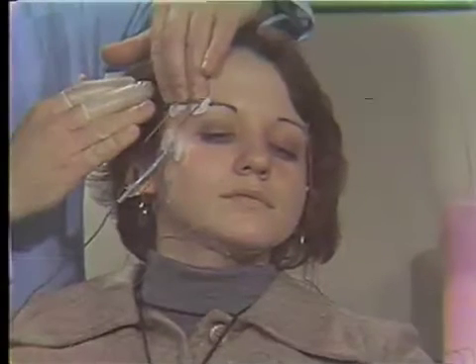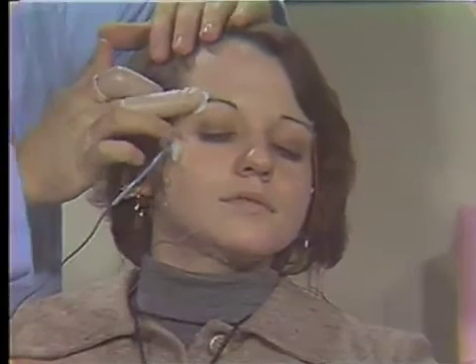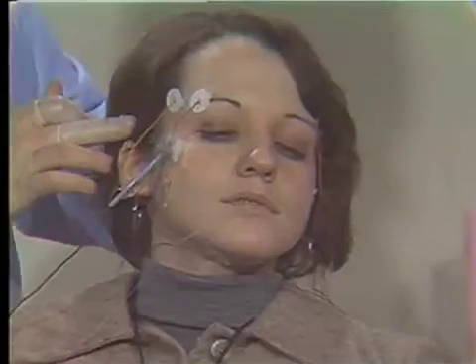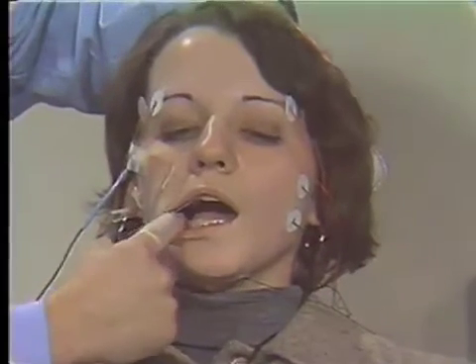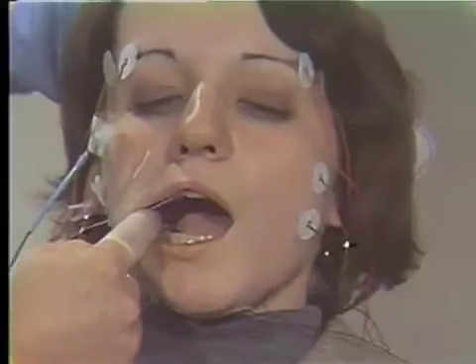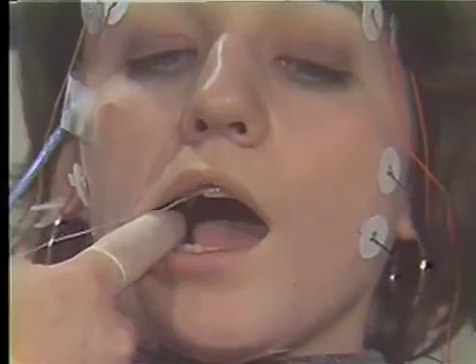Temporalis — just clench for me. Relax and you'll see the movement. And this is where our temporal electrodes go. Two muscles that we can't reach with surface electrodes: just open wide — the medial pterygoid, just open as wide as you can. Karen can't open too wide. And then the lateral pterygoid, right behind.